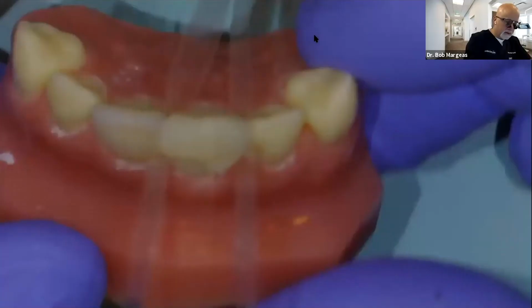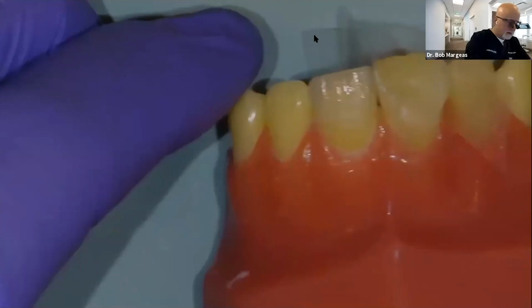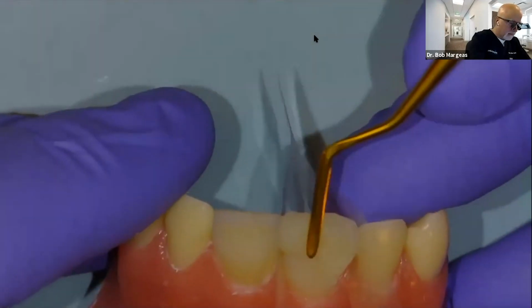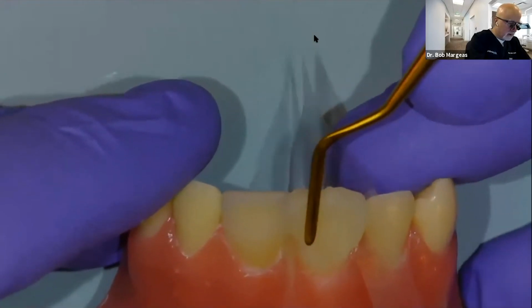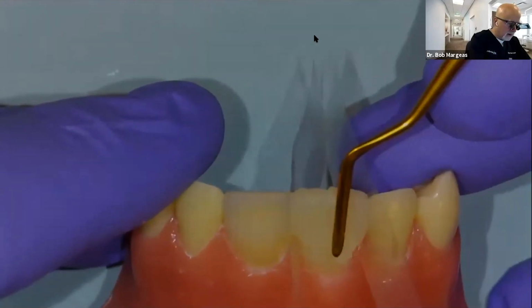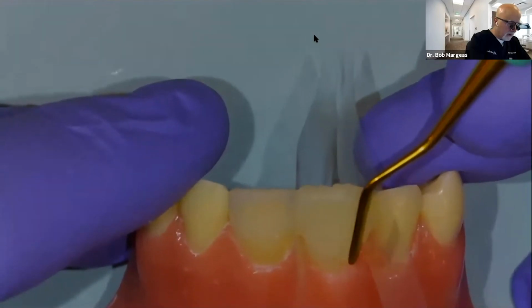And then what I want to do is move it up, force it. I'm trying to force it between the lobes and into the body of the tooth.